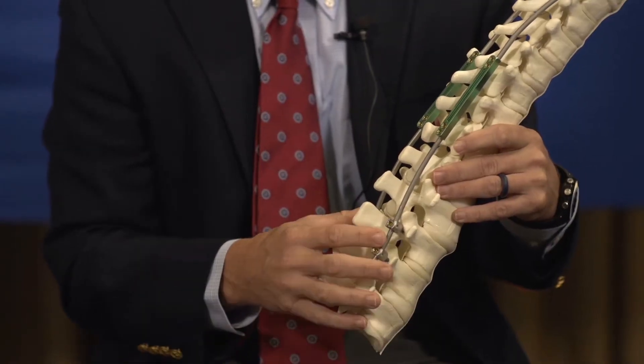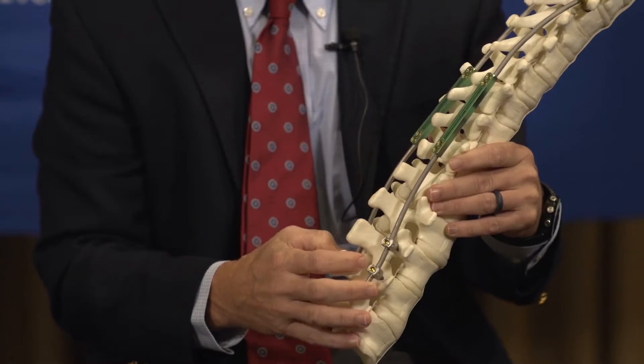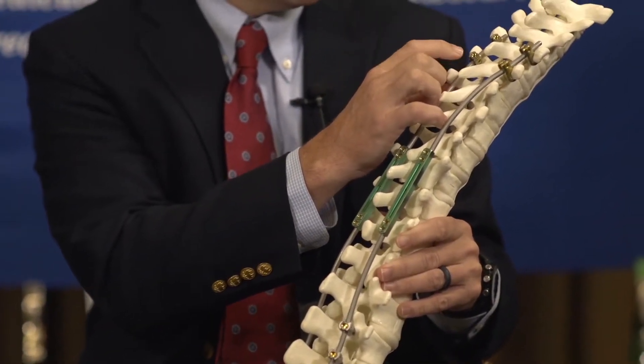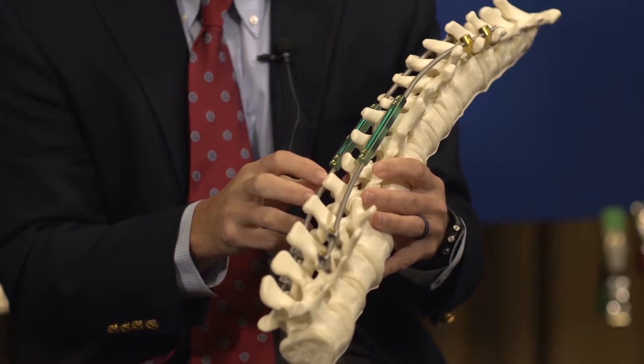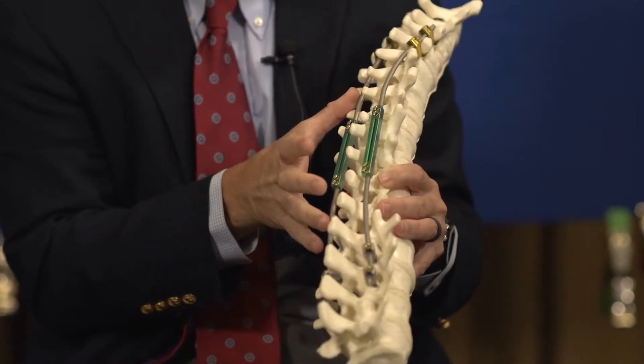There are two main types of growing rods. The traditional or original rods that I have here — this is a traditional growing rod construct on a spine model. You can see that the construct attaches to the spine bone using hooks or screws, and then the connecting device in between is where the lengthening procedure is performed, which will allow the spine rods to expand.